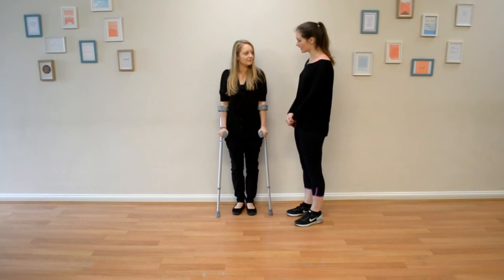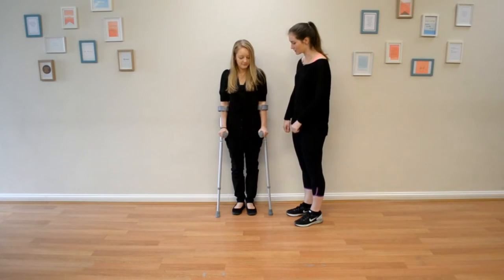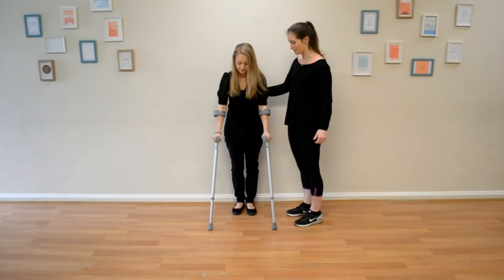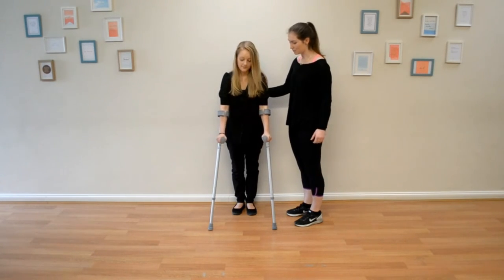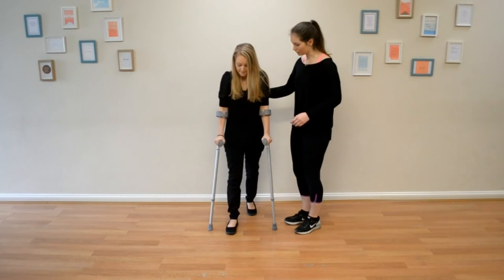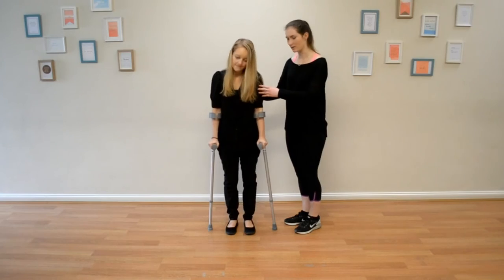So Alex, the first thing I'd like you to do is put your crutches forward just as much as is comfortable and just a little bit wider than your hips. Perfect. Now I want you to step forward with your sore leg so that it's in line with the crutches. Now pushing through your arms, step forward. Good.